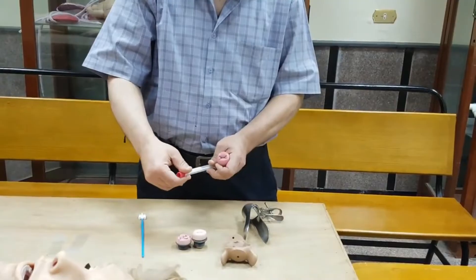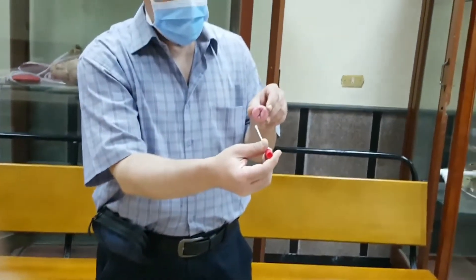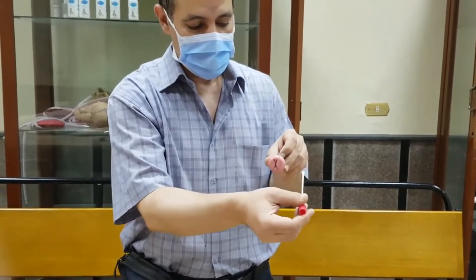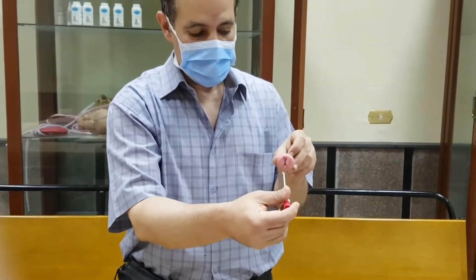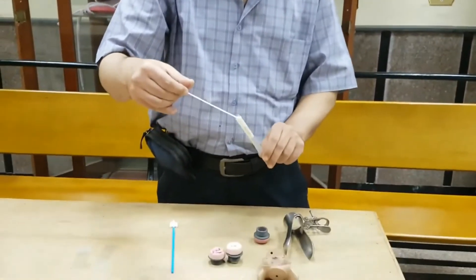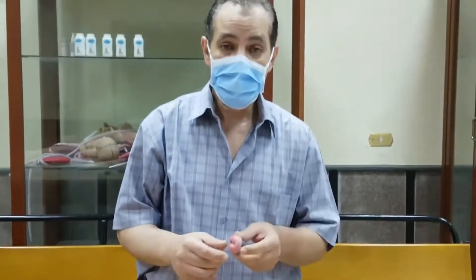Another way is to take another swab from the posterior fornix — posterior to the cervix. This part is called the posterior fornix; here is the anterior fornix, here is the lateral fornix, and here is the posterior fornix. Again, we rotate 360 degrees, then withdraw the cotton-tip swab, then insert it inside the tube and send it to the lab. This is the swab for infection, and I do that if there is any discharge, in sexually transmitted disease, and so on.